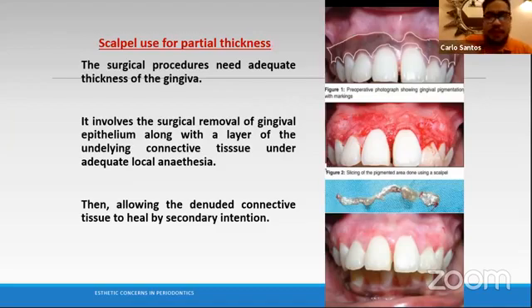You don't scrape it. Don't scrape it. You have to fillet that certain layer, that certain strata where the melanin is. So you'll see if it's pink. When you dab it with the gauze, it will turn pink, and then suddenly blood will rush up. So if you see all is pink, that's good enough.